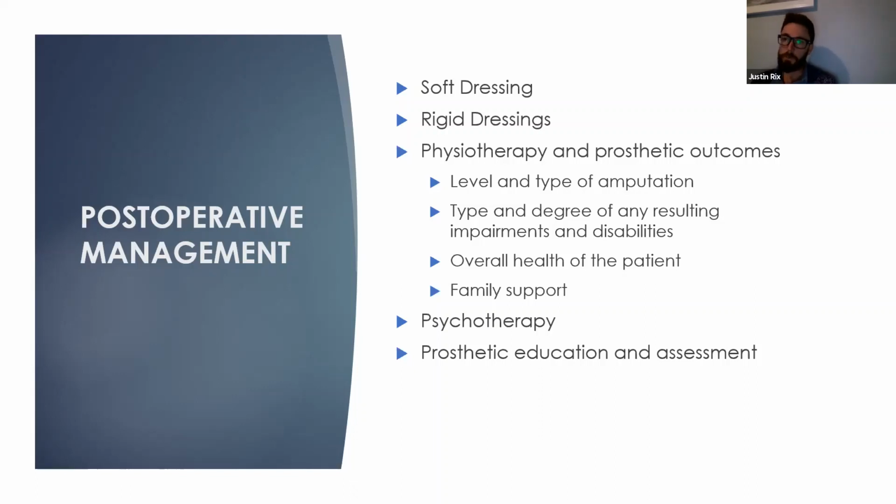Generally, the amputee will receive multiple sockets in their lifetime as a prosthetic user. It's not unusual for a primary amputee to require a new socket within 6 months after their first socket. As prosthetists, we try to increase the lifespan of the socket by padding the inside of the socket, applying polyurethane rinses, or using stump socks to take up the space within the socket until eventual refit is required. By limiting the initial swelling within the limb post-surgery, this reduces the time taken for the residuum to stabilize and the prosthetic aspect of the treatment to start.